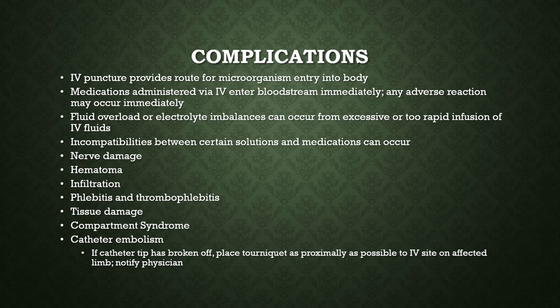And as I said earlier, medications administered IV enter the bloodstream immediately. Any adverse reaction is going to occur immediately. So you have to be prepared for that. So when I'm giving something IV, I'm very cautious. I'm thinking. I'm not letting people interrupt me when I'm calculating or figuring out the right rate. Sometimes I'll ask the person, hey, double check this for me. Make sure I got this right. Because you can't take it back.